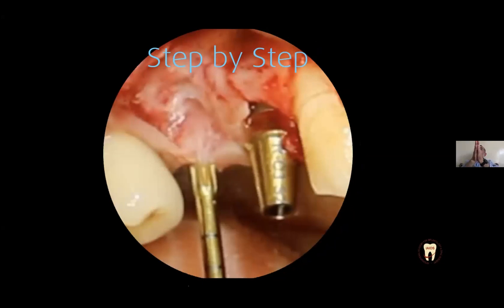You use this tip to give a pressure into the hole of your sinus. This pressure, you can regulate it gradually, and you don't have to have a big pressure into the sinus. You risk perforating your Schneiderian membrane. So you go gradually with the pressure, and you elevate your membrane step by step, gradually.